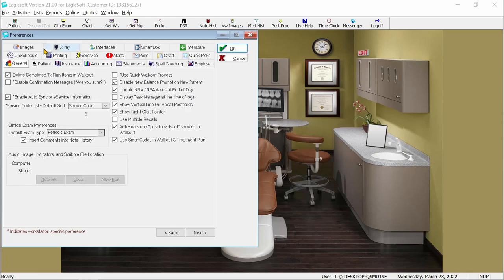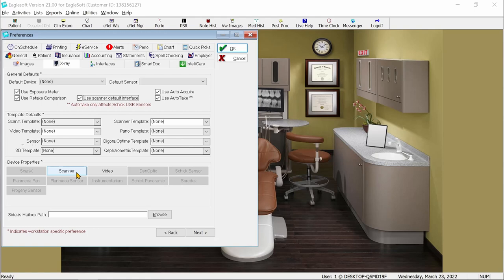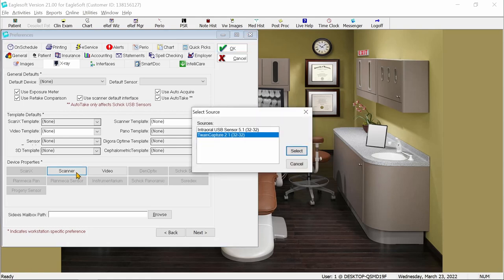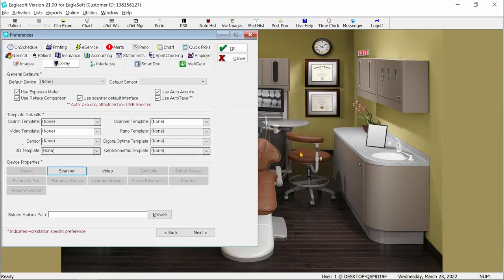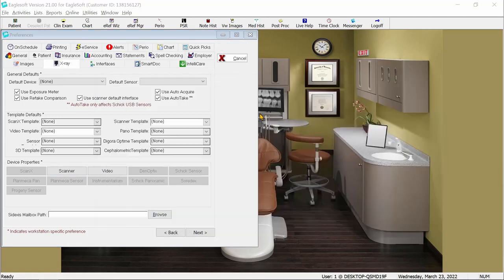In the Preference window, we'll select the X-Ray tab and check the box for Use Scanner Default Interface. And then, go down to the Scanner button and ensure we have Twain Capture selected as the Twain source. Click OK to save your settings.